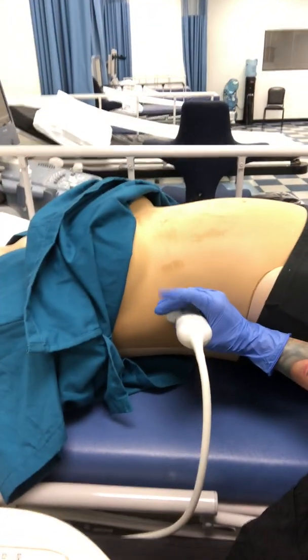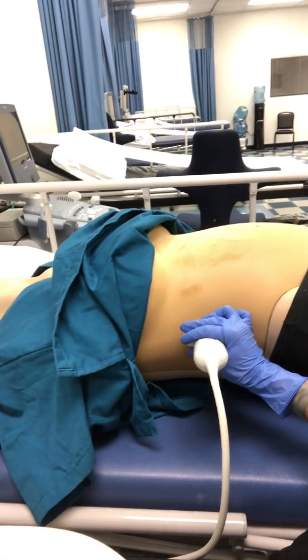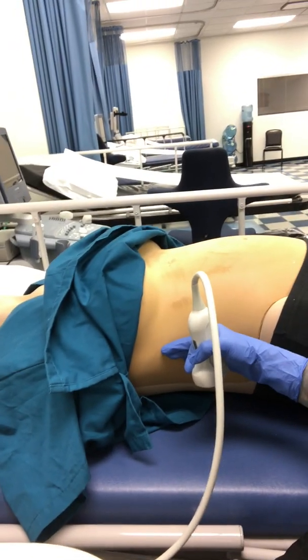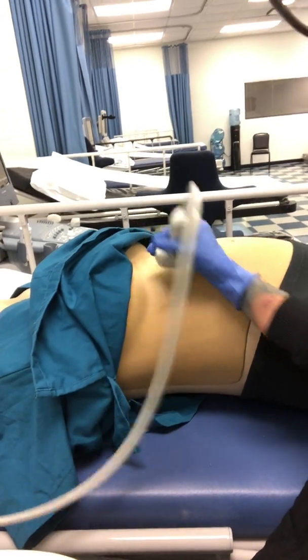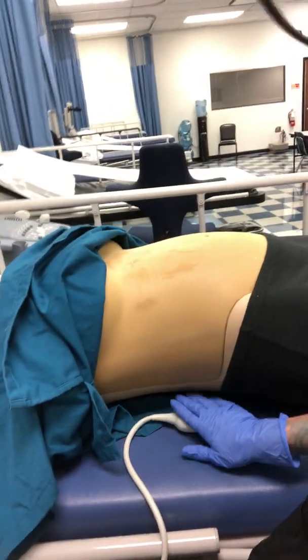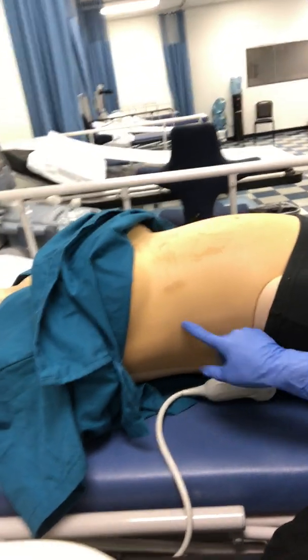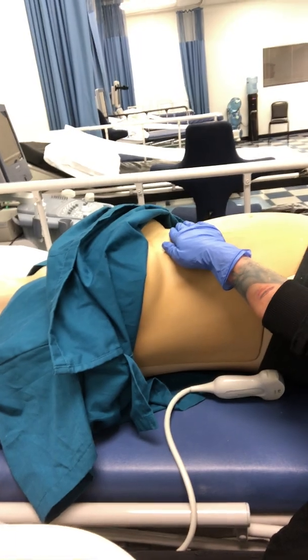So that is our two portion. So again, not just pointing towards the head, the exact opposite side is going to be pointing inferiorly. We are scanning from the lateral portion, the right lateral portion, and our beam is traveling medially into the patient. So again, if I put the probe down, I'm just going to use my hand. We are scanning top of the screen from our right lateral to the middle portion or medial aspect of the patient.